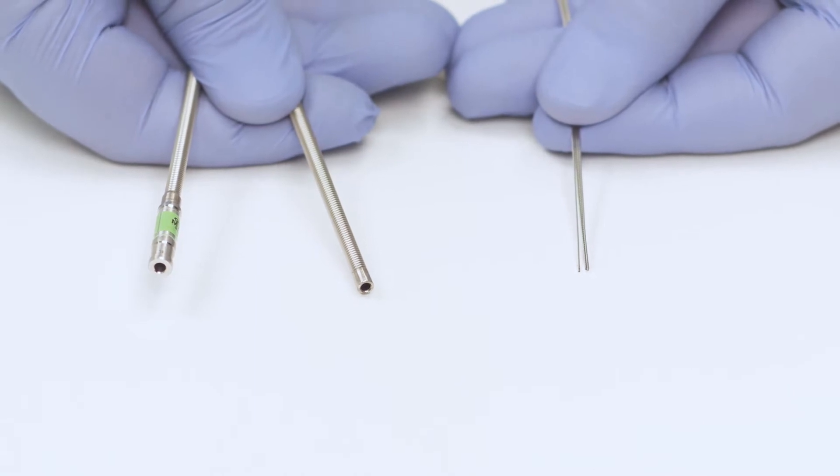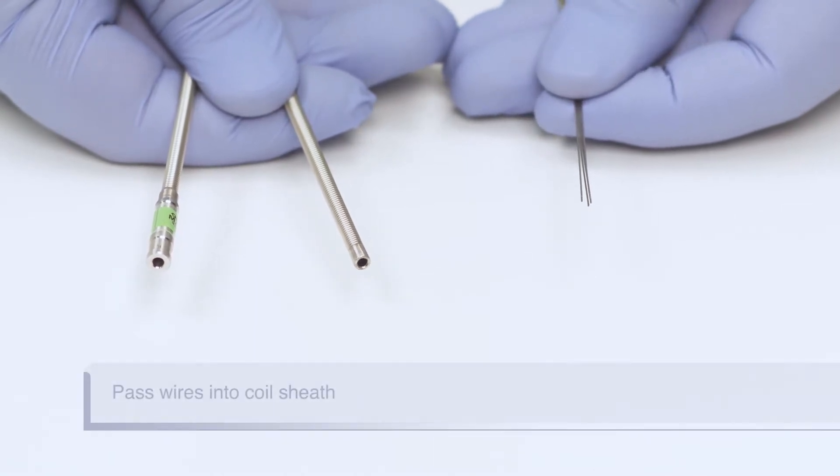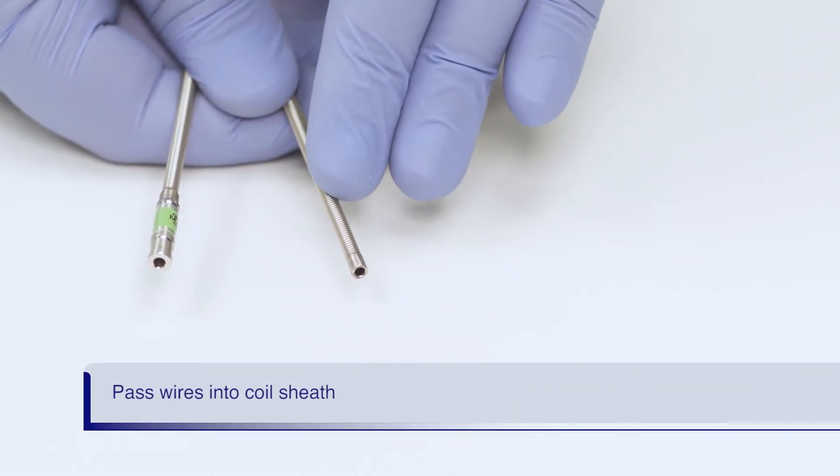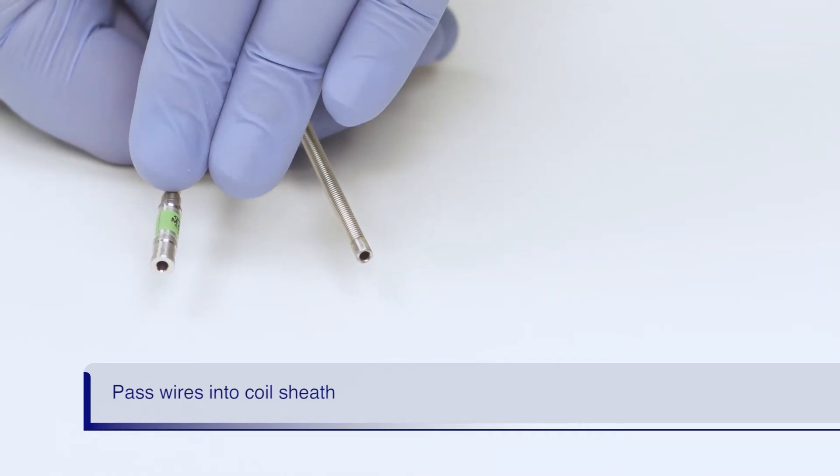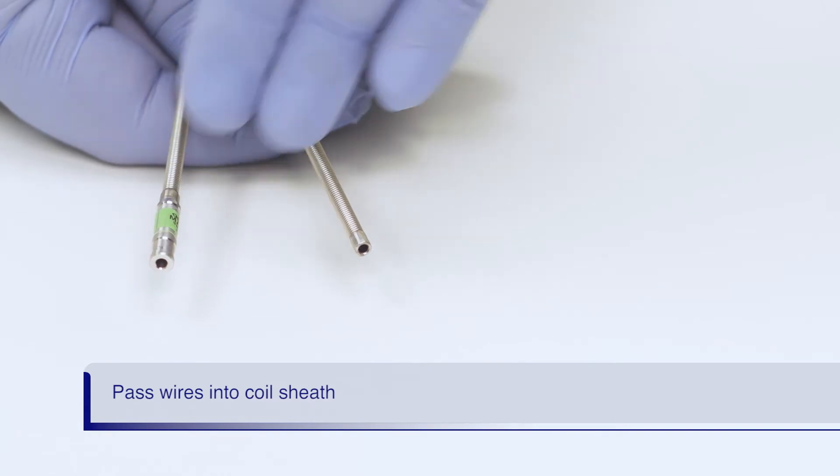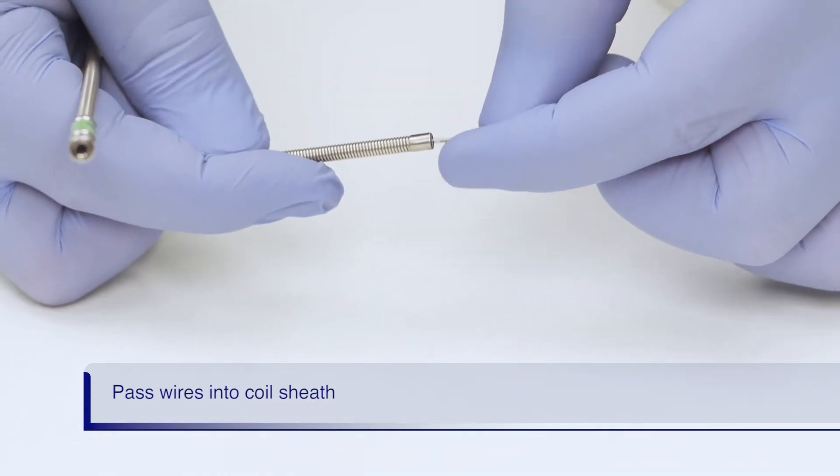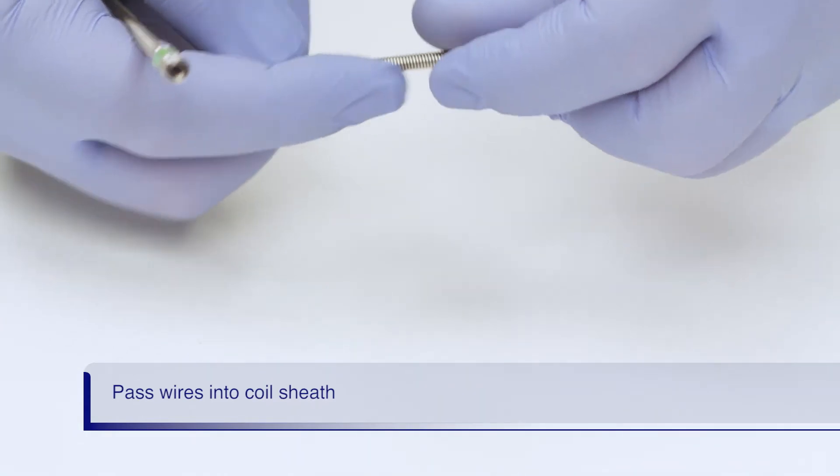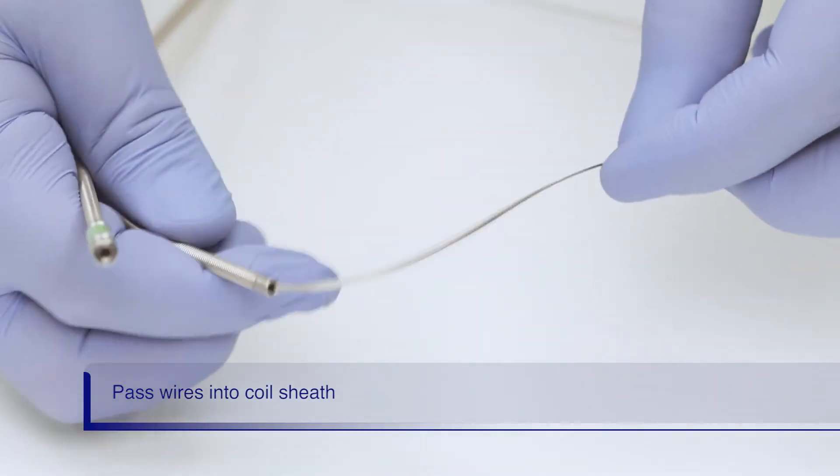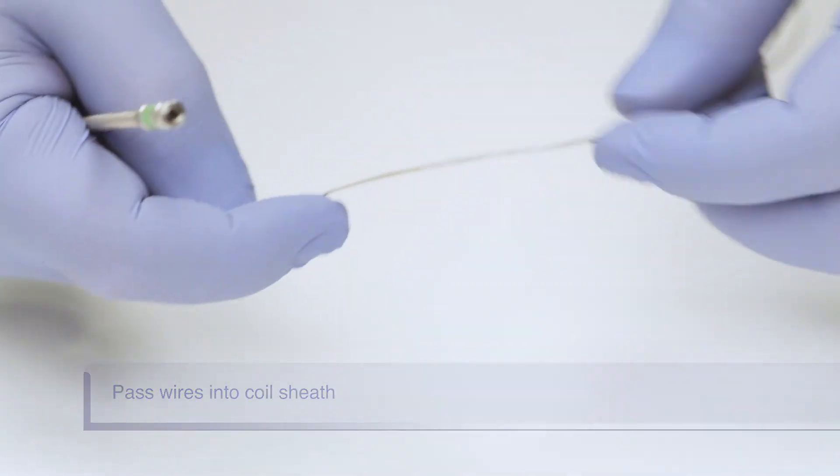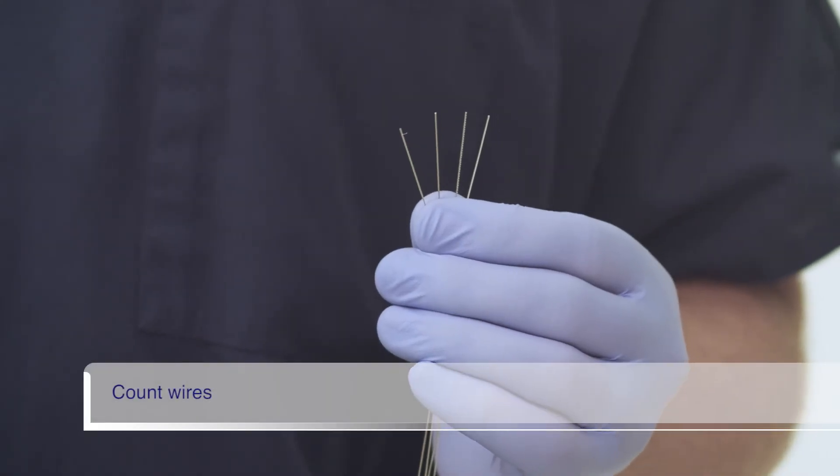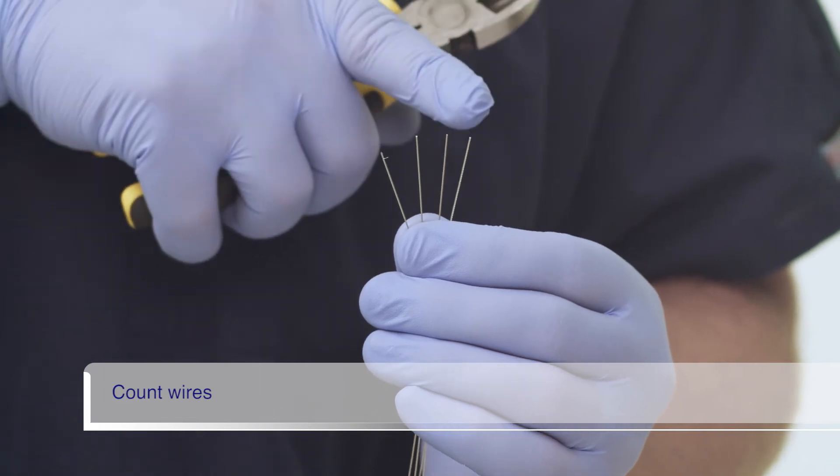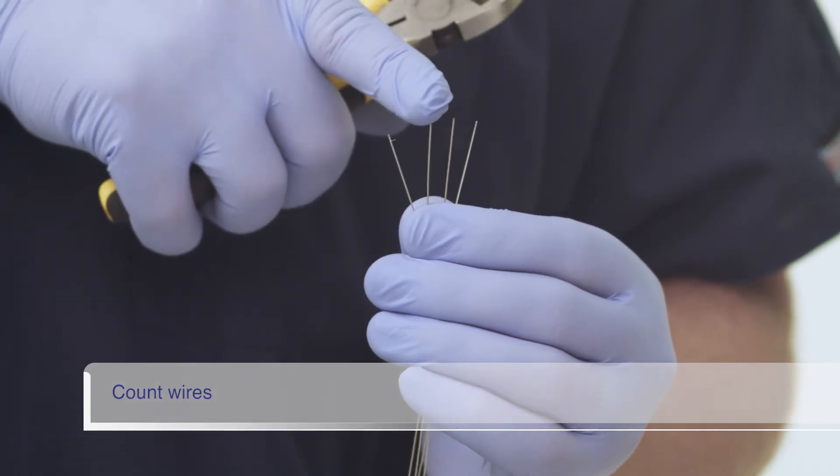The wires are now loaded into the coiled sheath. The wires are advanced through the unmarked, distal end of the sheath. The end with the green band is the proximal end and is connected to the handle later on. Ensure you keep the wires straight and together as you advance them through the sheath. Once the wires emerge from the proximal end of the coil sheath, count them to ensure all four wires are present.